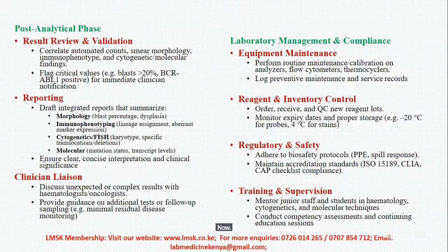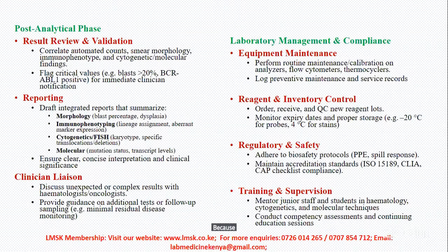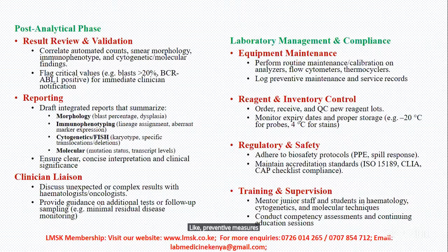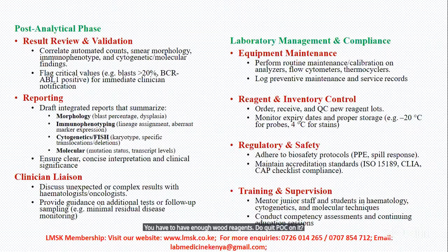Now, in terms of laboratory management and compliance, make sure your equipment is fully maintained in terms of calibrations, because these are sensitive things. You have to do preventive maintenance, like cleaning, like many things. And then also in terms of reagents and inventory control, you have to have enough good reagents, do quick QC on it, and also monitor expiry dates. And then also observe safety in terms of PPE. You have to check on spills and also check on other things in terms of accreditation standards.